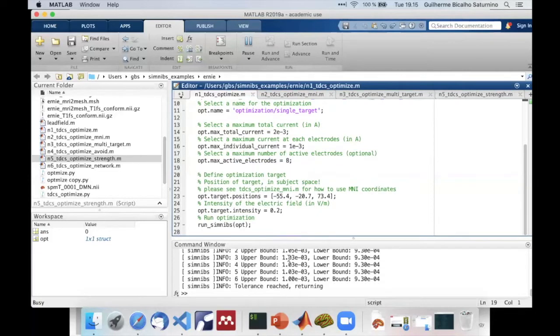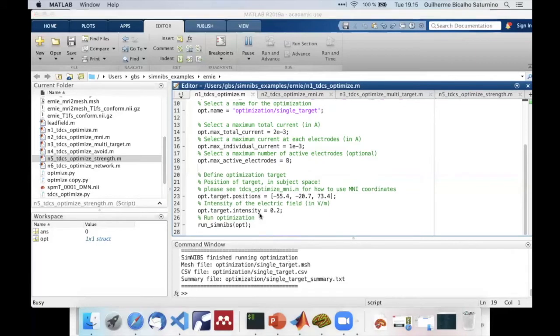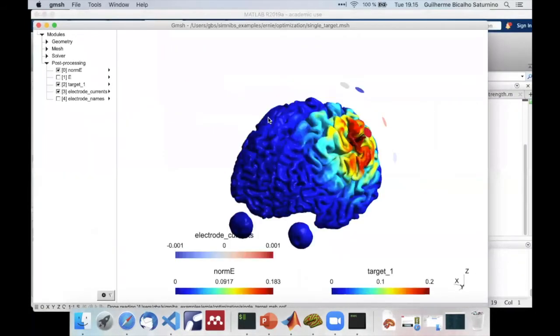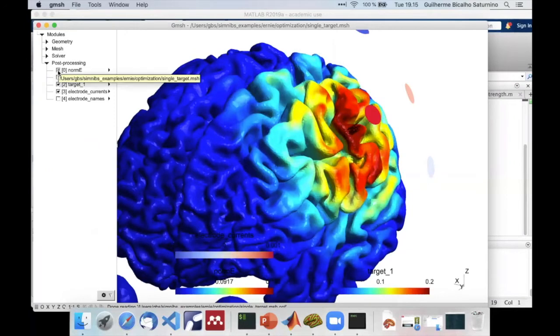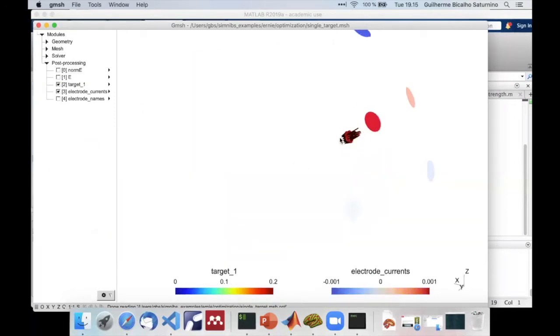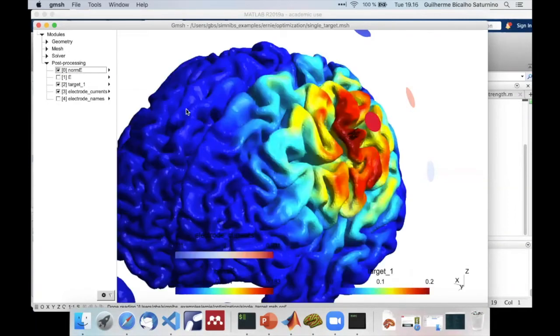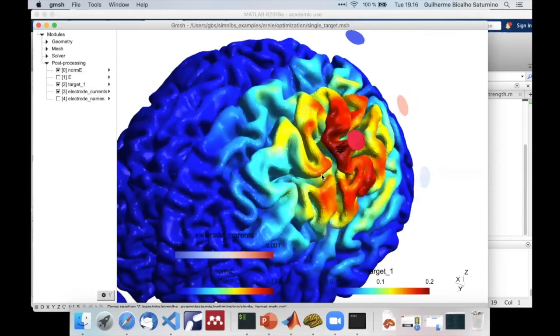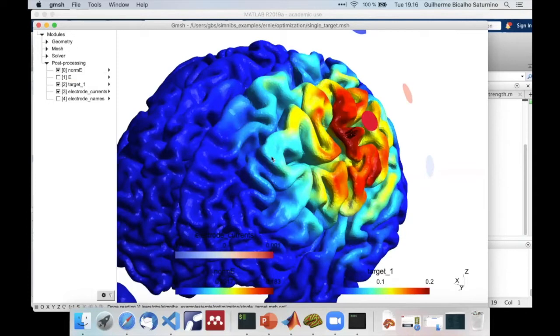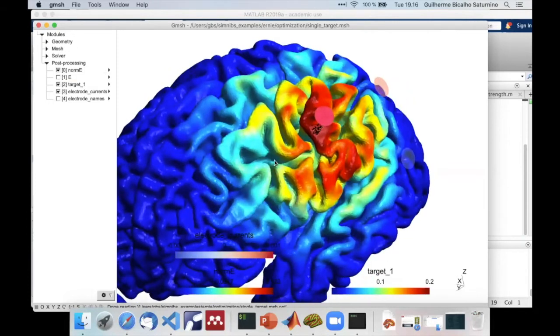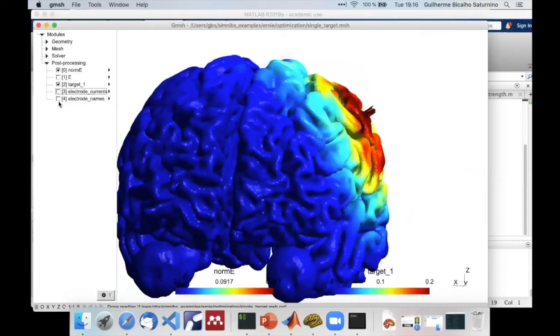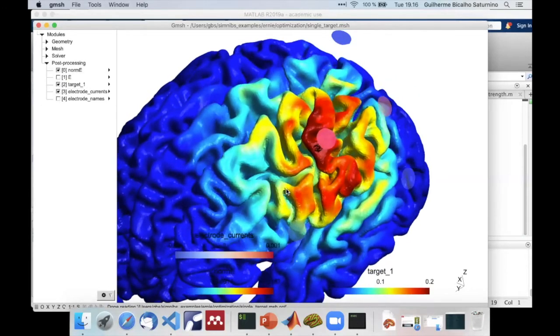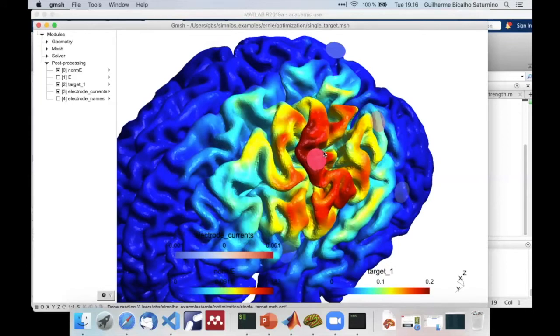Now I can run it. And it converged. And here's the result. Here we can see the target, which is both the location and direction. We have here the electric field norm in the cortex, which as you can see is more or less centered around the target region and spread out around it. I can also see the electric field vectors if I want to. And finally, I can see the electrode currents that I can use in order to create this electric field in the brain.